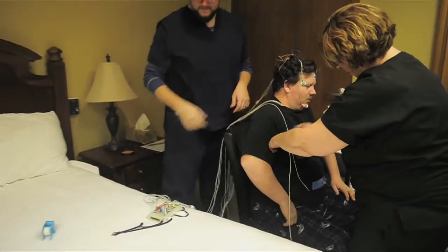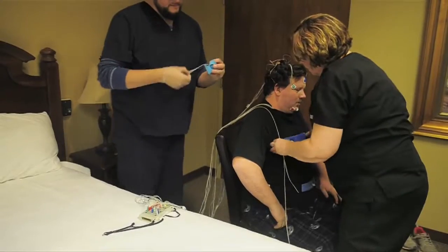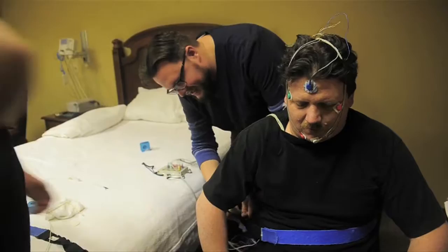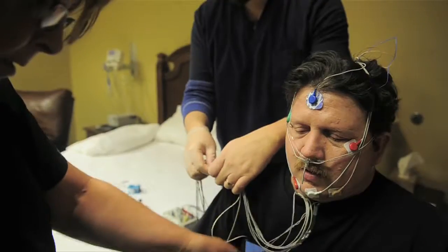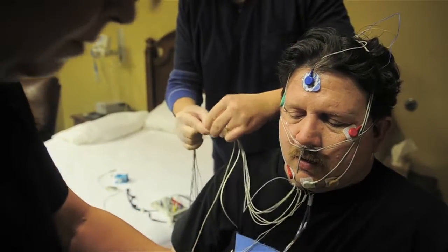From there we'll put some leads on the chest that monitor EKG to make sure everything's beating the way it should, and then we've got a set of belts that wrap around the chest and abdomen. There's a little sensor on each of them that shows us when the chest and stomach move up and down, so we're able to see when a person is making an effort to breathe.